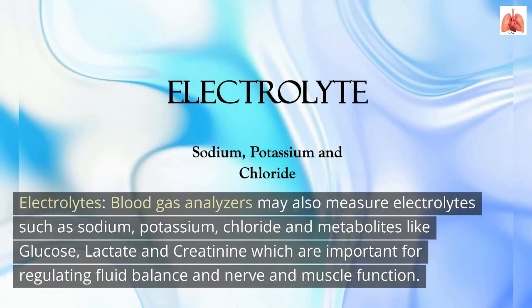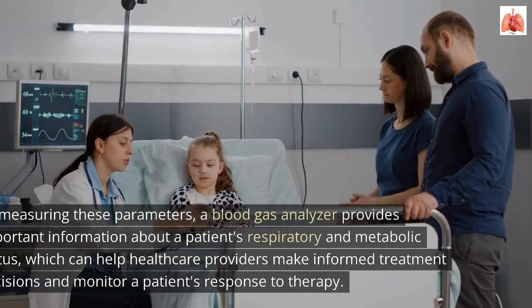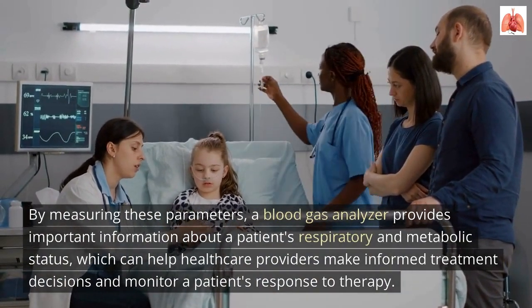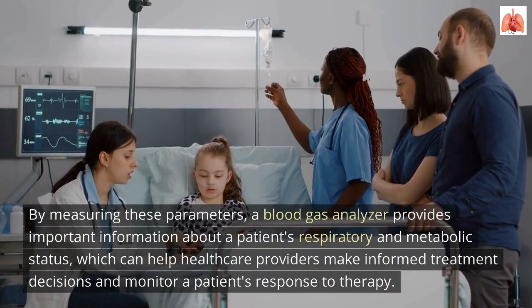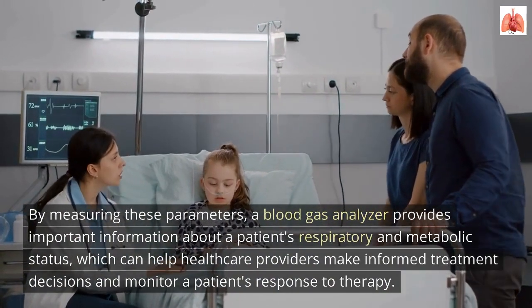Electrolytes. Blood gas analyzers may also measure electrolytes such as sodium, potassium, chloride and metabolites like glucose, lactate and creatinine, which are important for regulating fluid balance and nerve and muscle function. By measuring these parameters, a blood gas analyzer provides important information about a patient's respiratory and metabolic status, which can help healthcare providers make informed treatment decisions and monitor a patient's response to therapy.